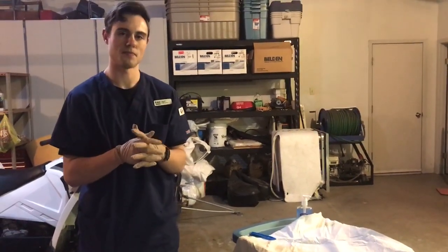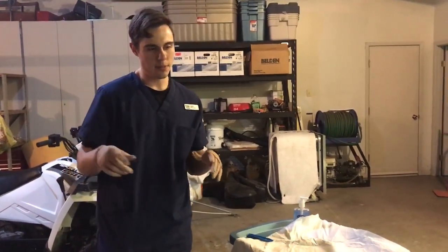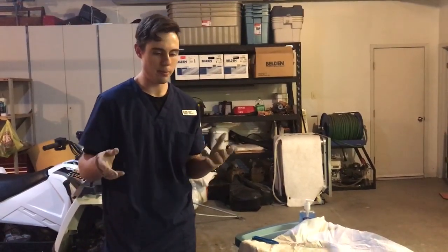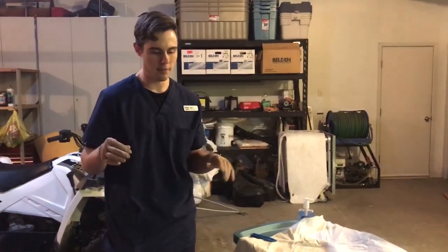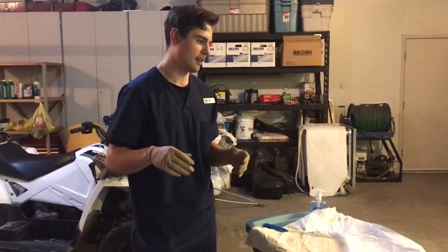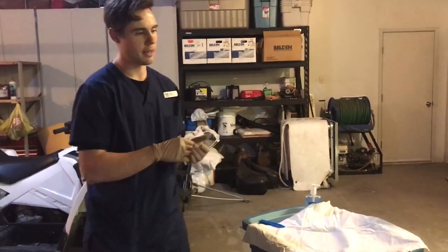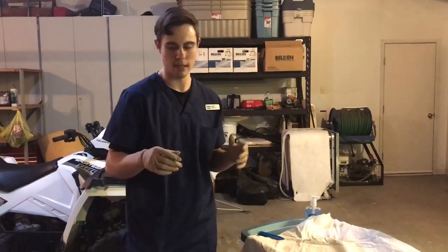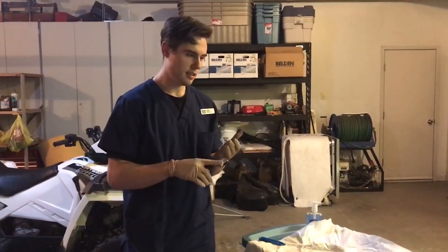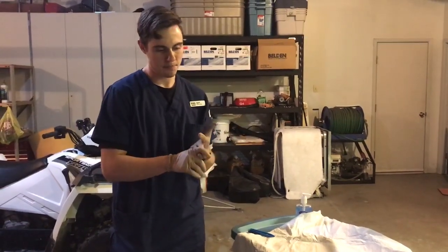Okay, so now you have a new order to remove the Foley catheter. Alright, so as per doctor's orders, I'm going to review the orders and make sure that it's appropriate to remove the catheter, and so the patient can void on their own now, and that's appropriate. So after that, I'm going to clean my hands and collect the supplies. So we're going to collect a 10 ml sterile syringe and an absorbent pad and clean gloves.